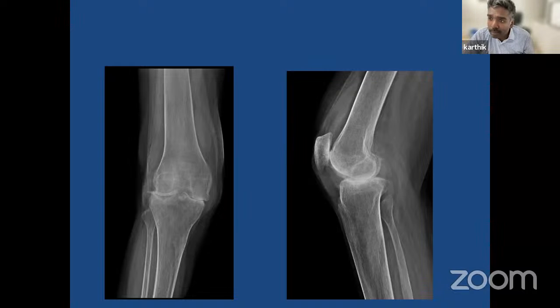The problem we faced intraoperatively in this patient, I want to discuss. We had a huge flexion-extension gap mismatch. His flexion just opened up and his extension gap was tight after taking the normal cut. We kept cutting and recutting as much as we could, but his extension gap was not matching the flexion gap. In the sense, I was still left with the FFD. So this was the situation. Have you ever faced such a situation? And what would you do in that case?